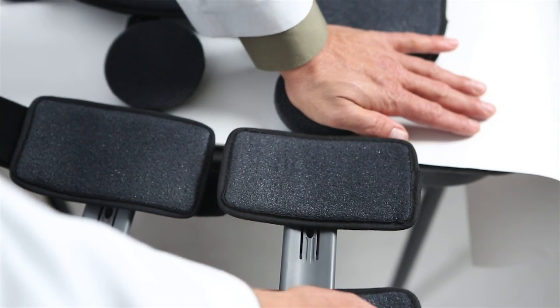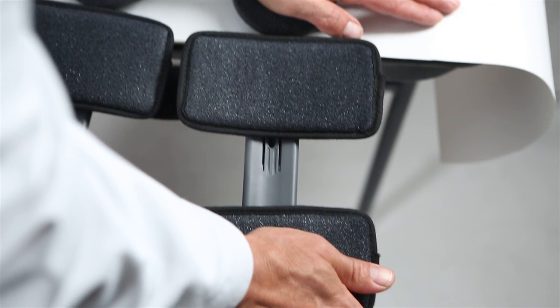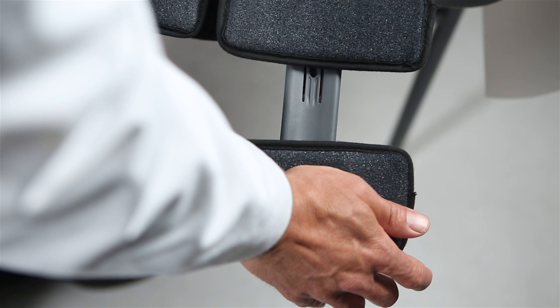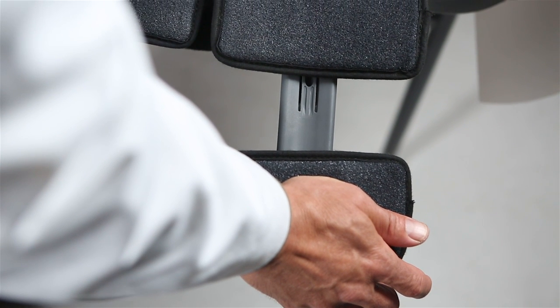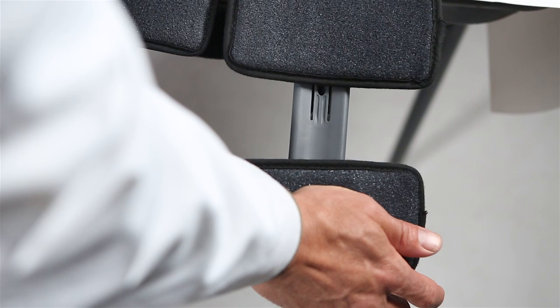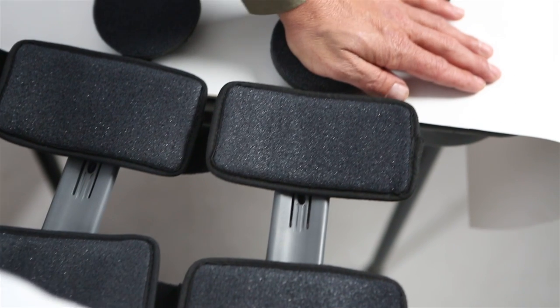Bend the hinge to add varus or valgus contouring. Bend each bar by holding the thigh-calf bar firmly against a solid surface and applying gentle, constant pressure to the hinge in the desired direction. Bend each sidebar an equal amount above and below the hinge.